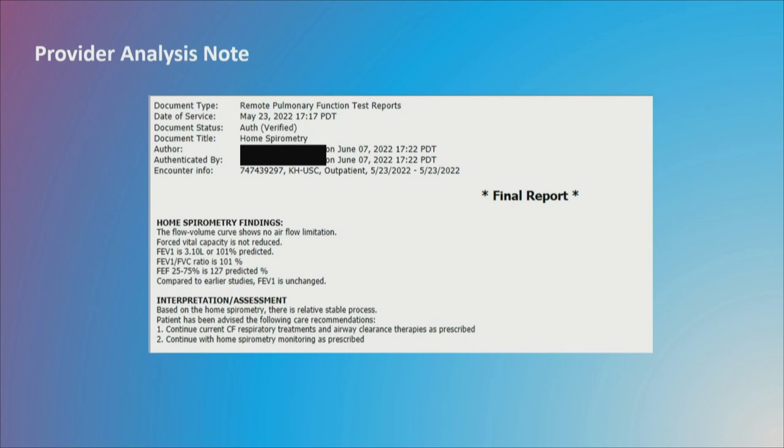This is our note after analysis for HS testing. If you want to take a picture of that. It's just very similar to Laura's, so you can make them all smart phrases. This doesn't have to be recreated every time.